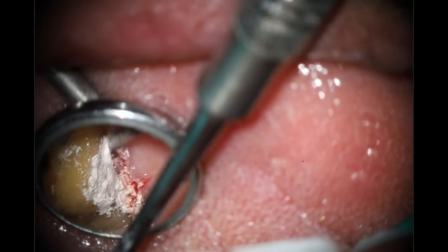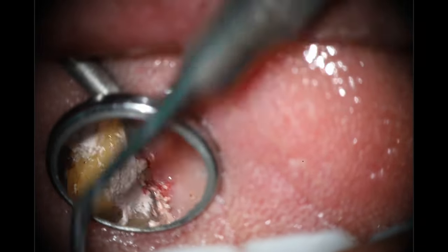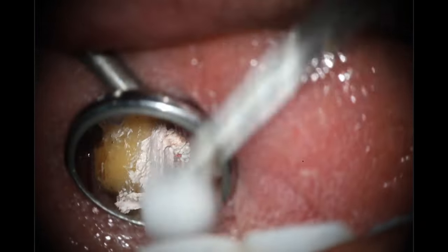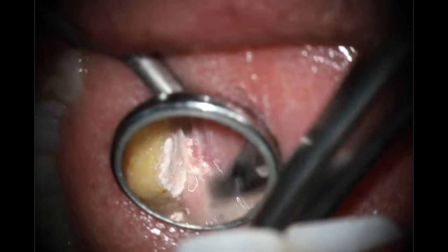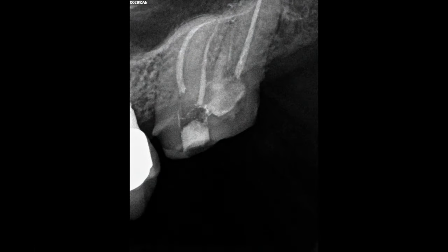Send it off to the dentist. Talk to him the next day — she felt great, no pain whatsoever, which is fantastic. He said it was quite the interesting crown prep, to say the least — so we were both struggling here. I know his wife is a dentist as well, and she was very impressed that we were able to try and save her mom's tooth here, because definitely not the easiest case of all time. You'll see here, the x-rays — because of her palate and just how everything was shaped — not the easiest. So that shows the two buccal roots, that crazy curve is pretty visible here as well, as far as the rotation of the tooth. And you can see she doesn't have a lot of bone for an implant in this area, so if we can buy her some more time, I am completely happy with that.